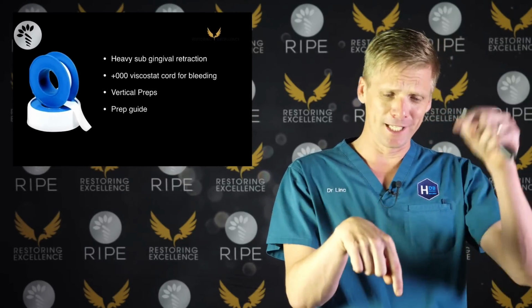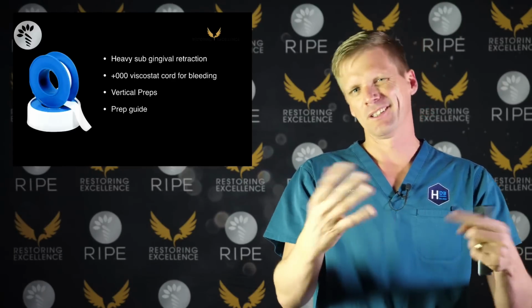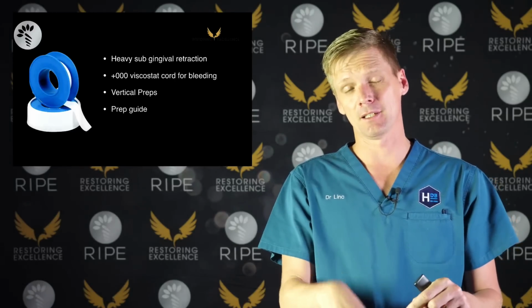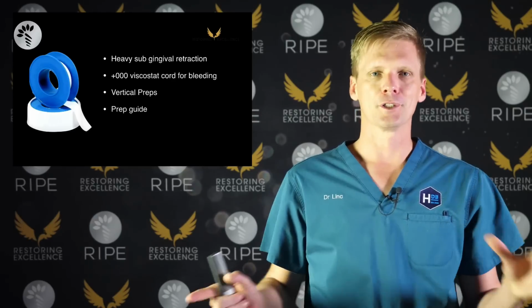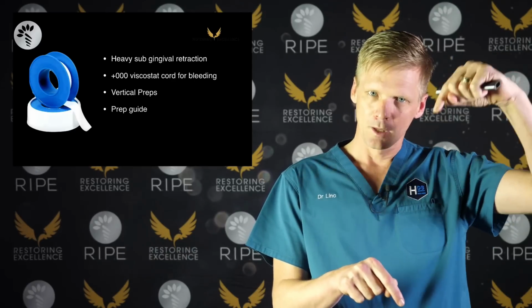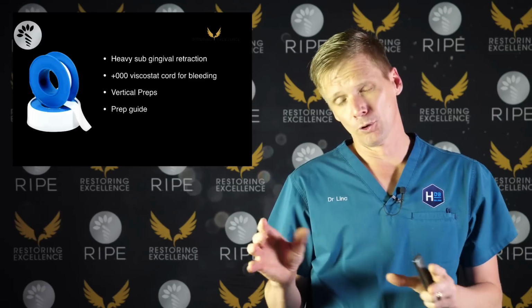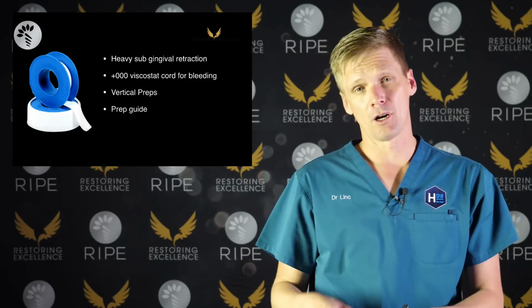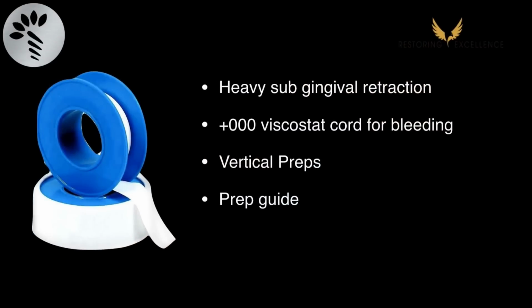If you're using Teflon, you need to hold it down on one end, and usually with a perio probe, and you can use a fancy packer. I actually just use a flat plastic instrument for packing everything. I don't have a dedicated cord or Teflon packing instrument. I just use a flat plastic, and I get my dental assistant to hold the perio probe on one end if it keeps coming up. It does help a little bit if your tooth is dry and your instrument is wet, because the Teflon gets a lot of static electricity, and if you get static on it, it will stick. I usually roll mine up first to form it into a Teflon cord.